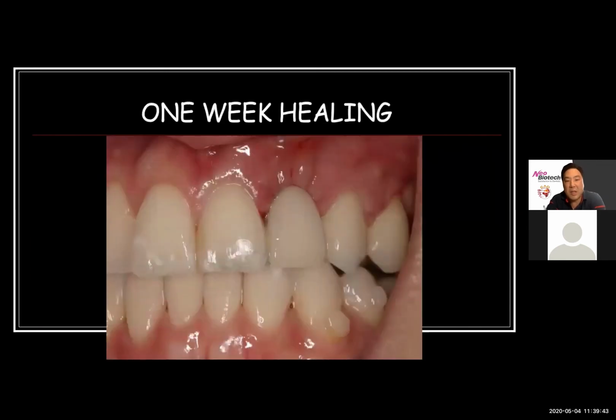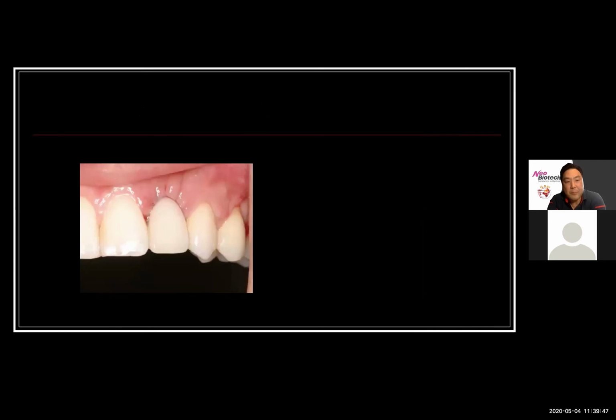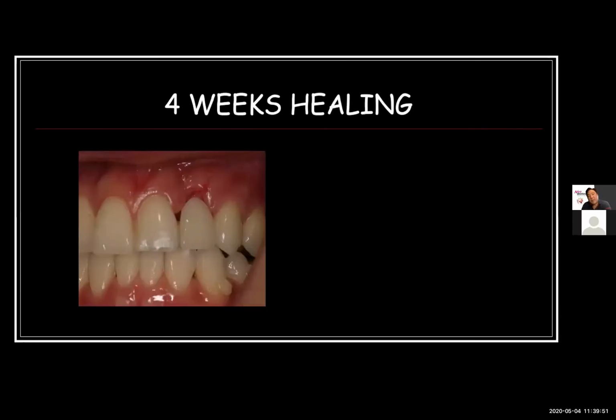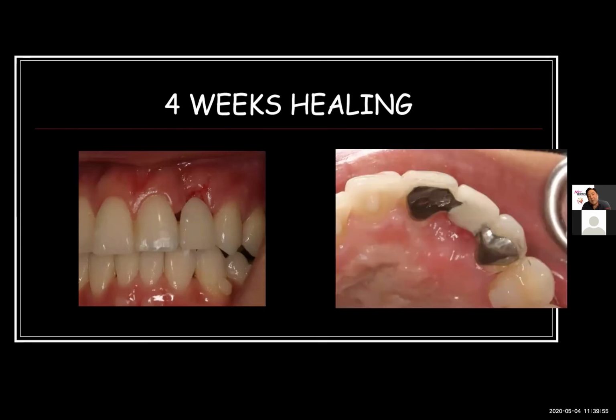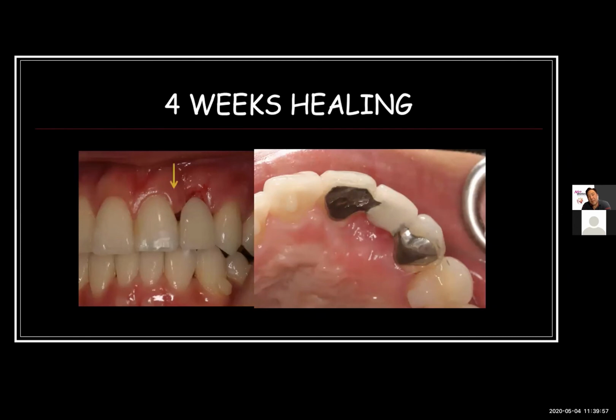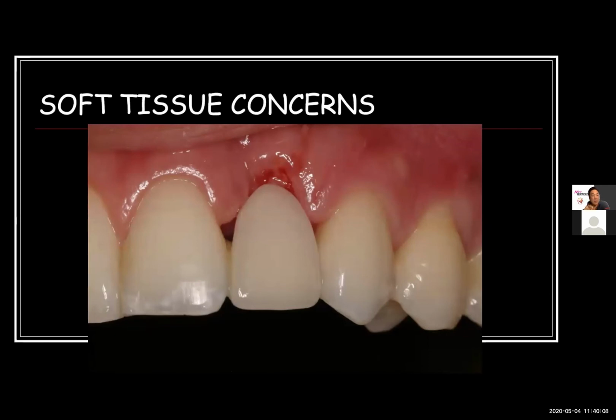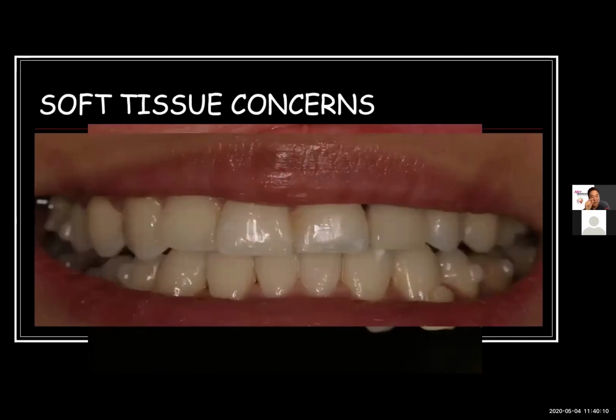And so you can see here the healing after 1 week, soft tissue starting to mature. And then 4 weeks later, now look what's happening here, right? And you can say to yourself, oh my gosh, right? What do you see here? Nice healing from the palatal. But that area there, even though we did all that hard tissue grafting, even though I did some soft tissue augmentation, I'm still getting a loss of soft tissue support there. I'm still getting this area of deficiency.